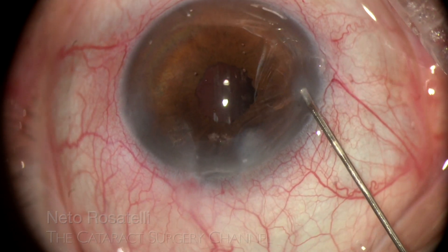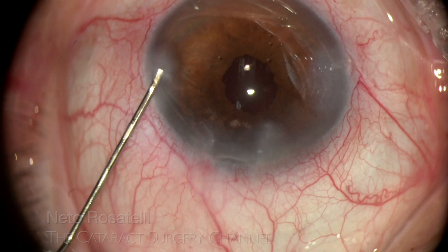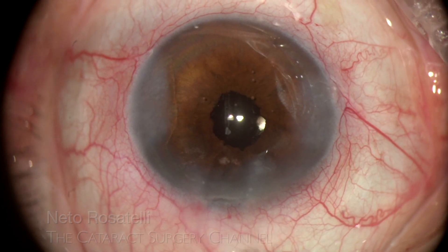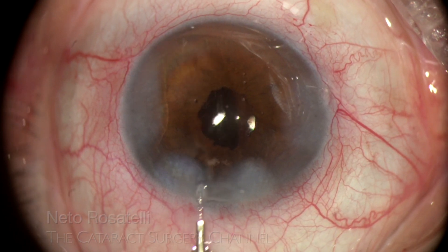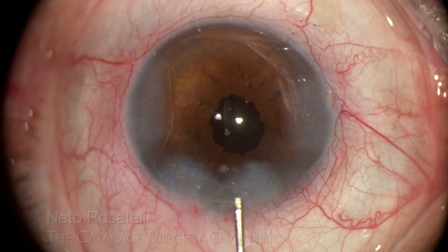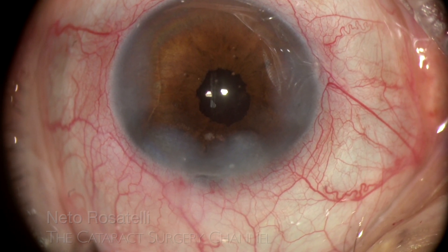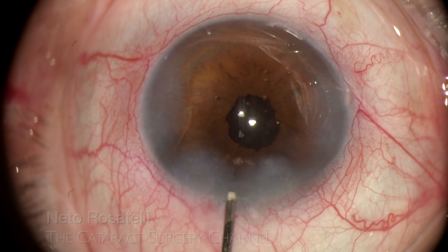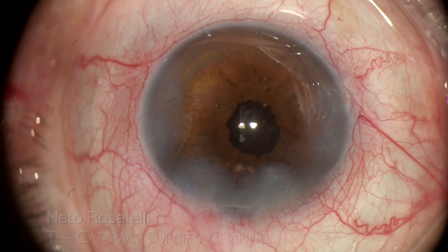We can see that thanks to all the care and measures we took in managing this fibrotic pupil and use of the pupil expansion device, the pupil ends up nicely round and functional — an outstanding achievement taking into consideration the initial aspect. I hope these tips help you in managing small pupil cases, where use of a pupil expansion device is always the smart choice for ease and safety. Patience, planning, and care always pay off in complicated cases, for a most satisfying result.